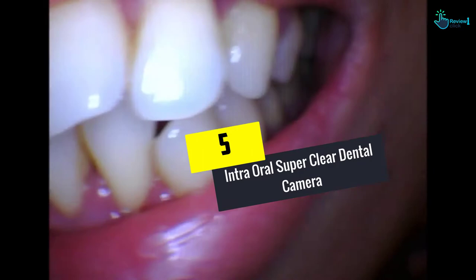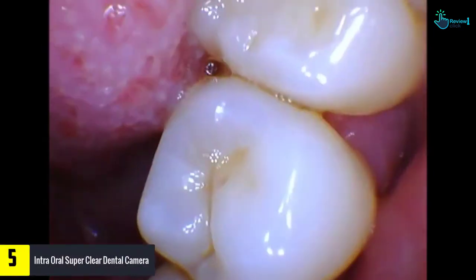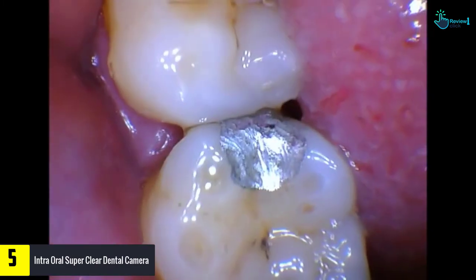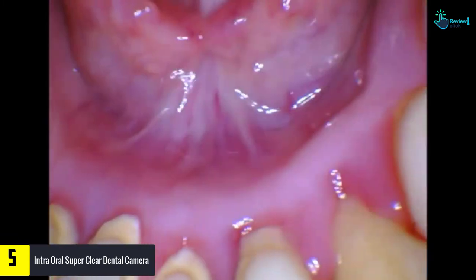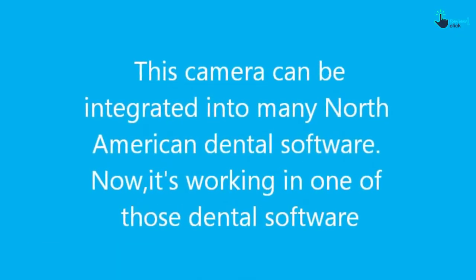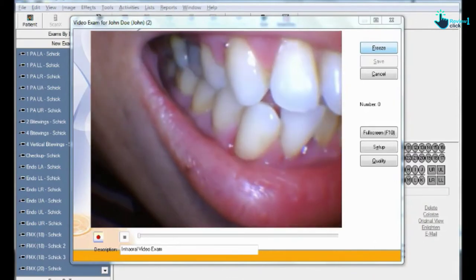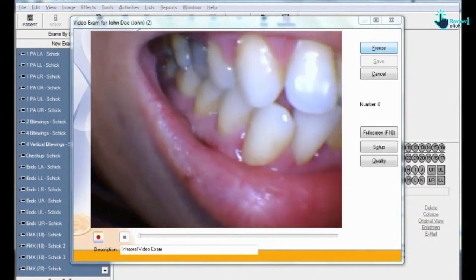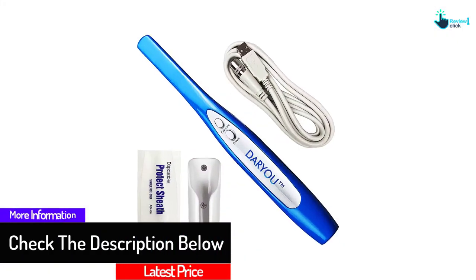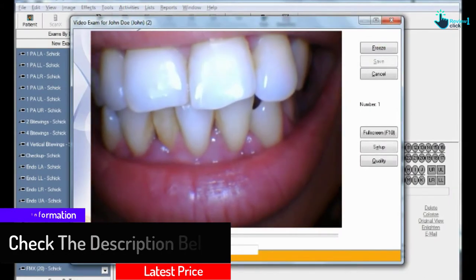Starting at number 5, we have the Intraoral Super Clear Dental Camera. This camera comes from a reputed brand and is available as a complete set. It has a cable of 2 meters and saves images in JPG format. It includes 5 pinholes, a connect port, and a sensor of 5 megapixels with an output of 640 by 480 pixels. It also includes a USB port that lets you connect it to computers with ease.